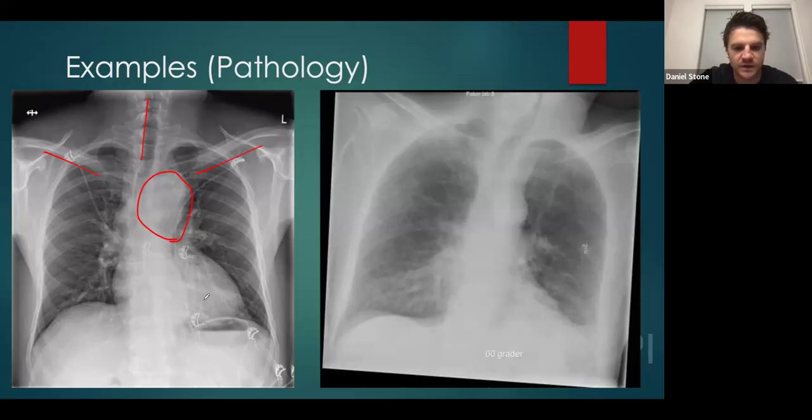It's pretty clear that the patient has some degree of dissection just based off the fact that the mediastinum is widened and also dense. You can tell that the density of the mediastinum is a little bit more. If you've seen enough of these pictures, the ability to look through the actual mediastinum is obscured basically by the density.